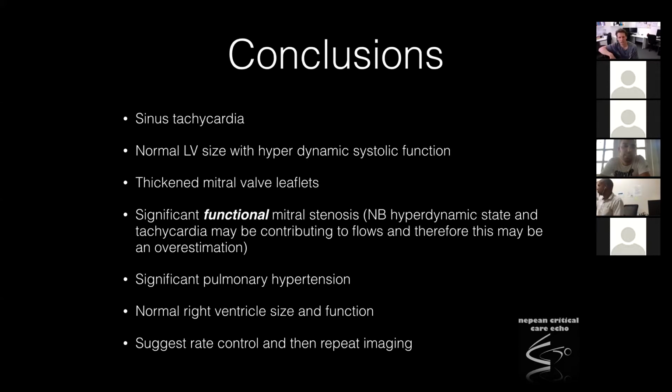Good case. I think it's a real deal, and I think these kinds of cases highlight why we need to be learning to do advanced echo. Again, I'm not suggesting that we should all be reporting, and of course the cardiologists have a slightly different bent on things because of their outpatient work. But for the critically ill, this is a real entity, and I struggled to persuade the cardiologist that this was affecting this patient's care. It's an example of why we need to know how to do echo, because there's no doubt in my mind that this was stopping her getting off the ventilator.